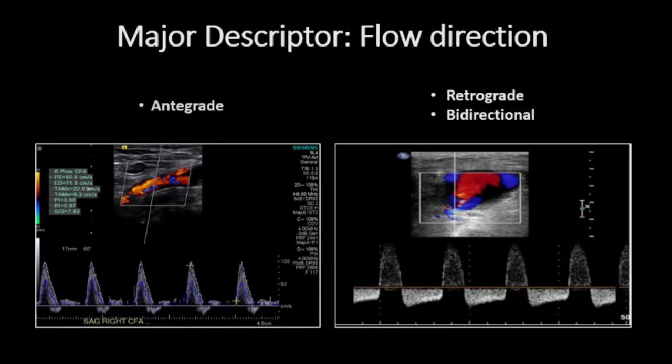Taking a focused view of flow direction, ultrasound detects antegrade flow, retrograde flow, and bidirectional flow. When the ultrasound transducer is correctly oriented, the baseline serves as the determinant for antegrade versus retrograde flow. The left image demonstrates a standard display of normal net antegrade flow in a peripheral artery. On the right, a unique bidirectional flow pattern is captured, with above and below baseline signal evident.